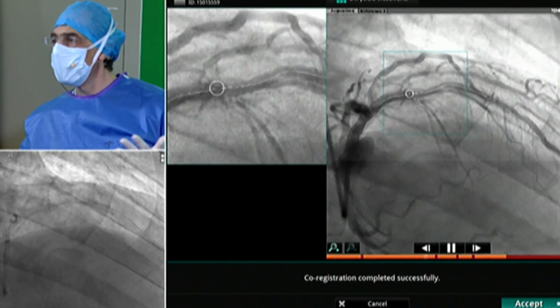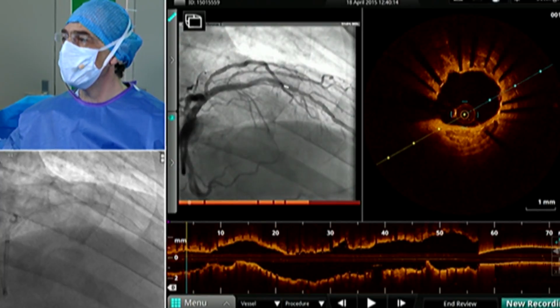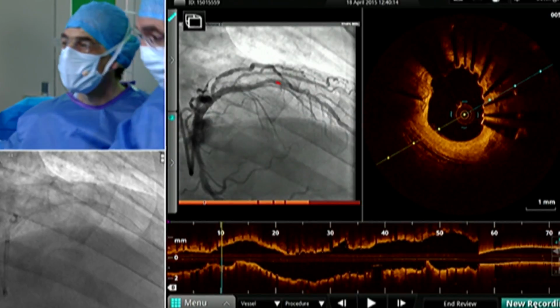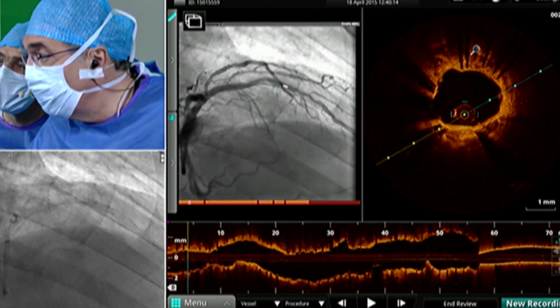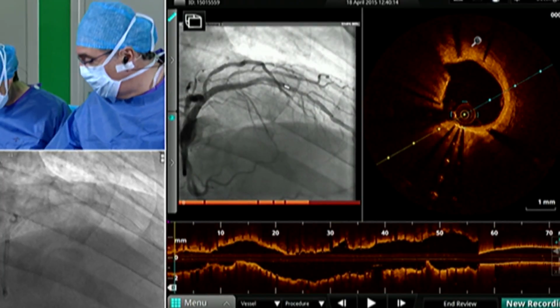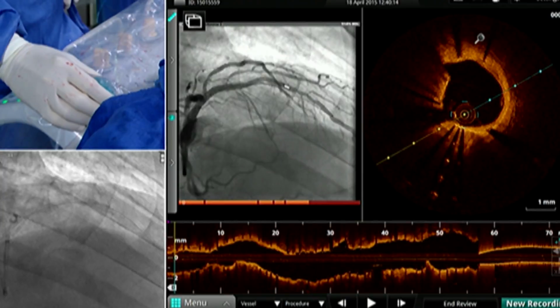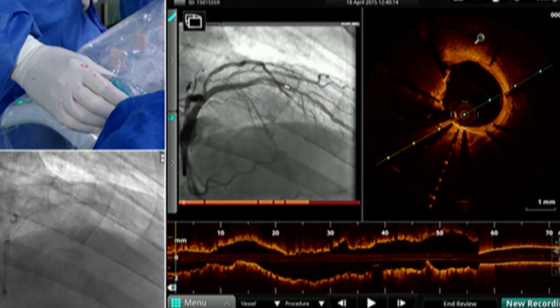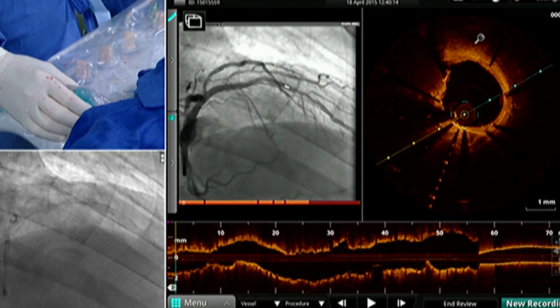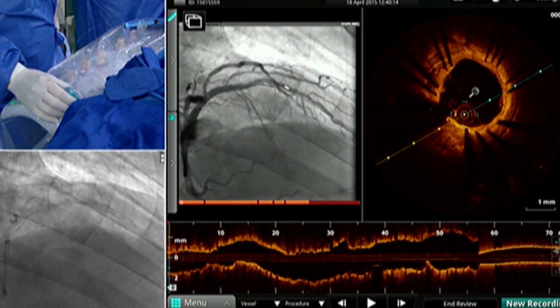It's telling you exactly from where, so the vessel is okay. So here we are inside the old stent. You can see the calcification. Now I'm going back. And you see the white marker, and Giulio is manipulating this joystick here. You can move the placement of the white marker, and it's synchronized. So what we are seeing in the two-dimensional view and the longitudinal view is exactly the point.